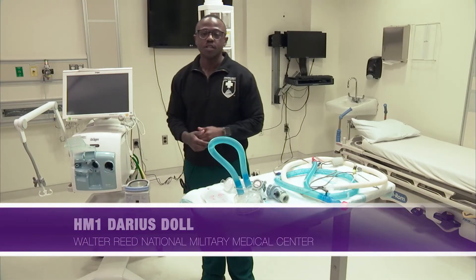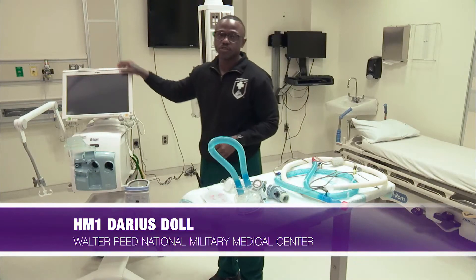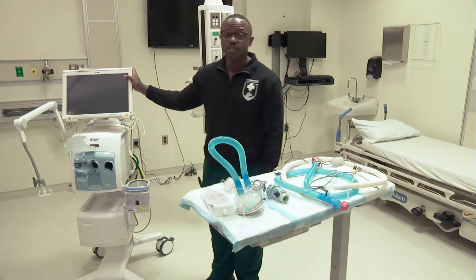Hello everybody, it's HM1 Dahl. Today I'm going to be speaking to your V500 Draeger. This device here we primarily use in our ICUs.